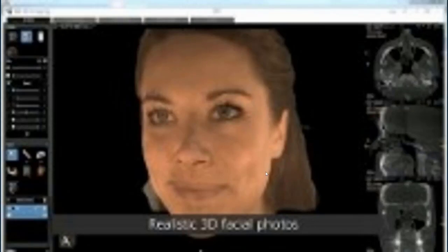Very, very useful. And that's not a small detail. I know I've jumped from $10,000 to $20,000 scanners up to 100 something thousand, but if you already need a cone beam and you're interested in this stuff, this should be a big value added thing that maybe kicks you towards that Carestream scanner, because that automatic stitching between all of these pieces of data is not a small task. It takes a decent amount of time to do that, so bear that in mind.